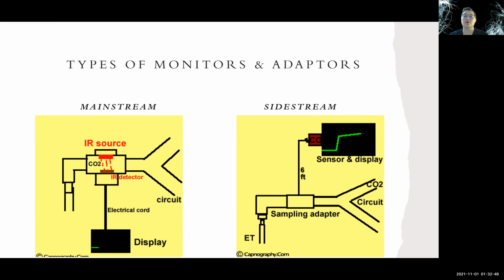Limitations do apply to colorimetry though. Even though it's a useful device, it mostly is going to confirm endotracheal tube placement, but only in patients that are not in cardiac arrest. With patients in cardiac arrest, a value of less than 0.5%, this device is virtually going to be of no use confirming whether the endotracheal tube is in the right place or not.